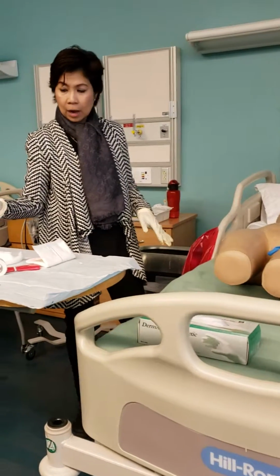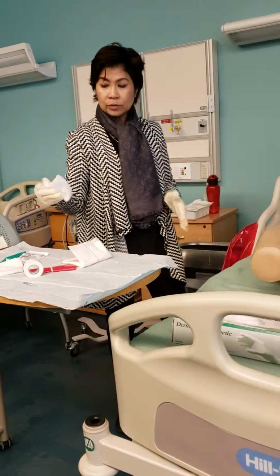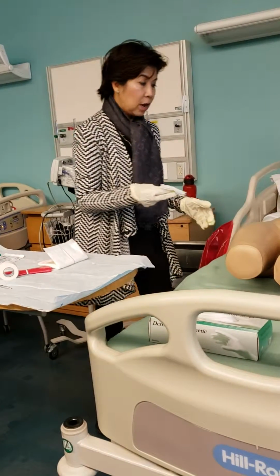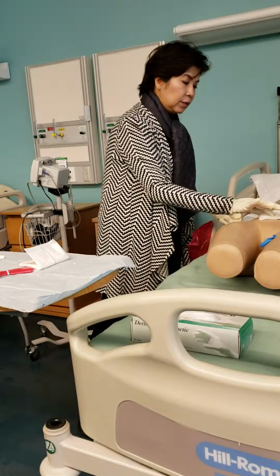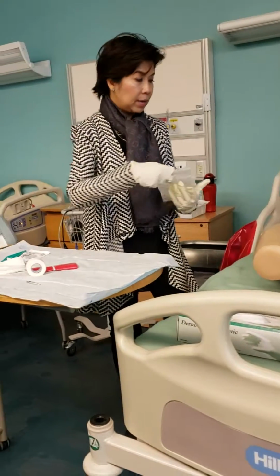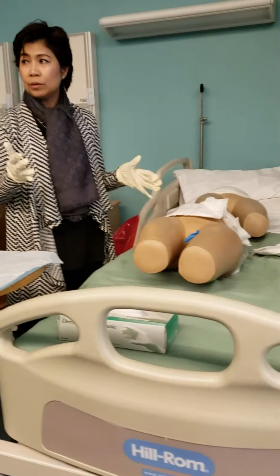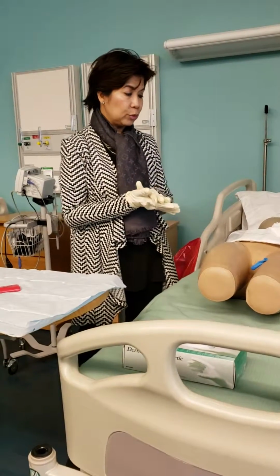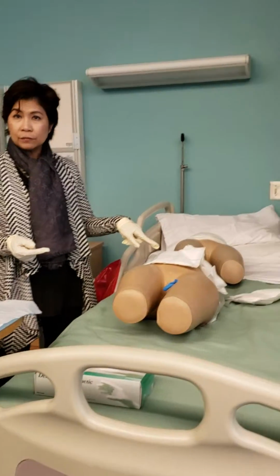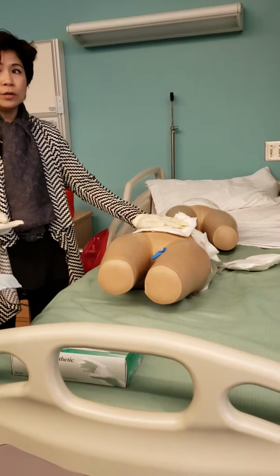What I would do for this, since I don't have a lot of gauze, I would still put gauze here, and then my ABD pad, so you're not touching it. It's super absorbent. You can break the sterile field at this point because it's already covered.